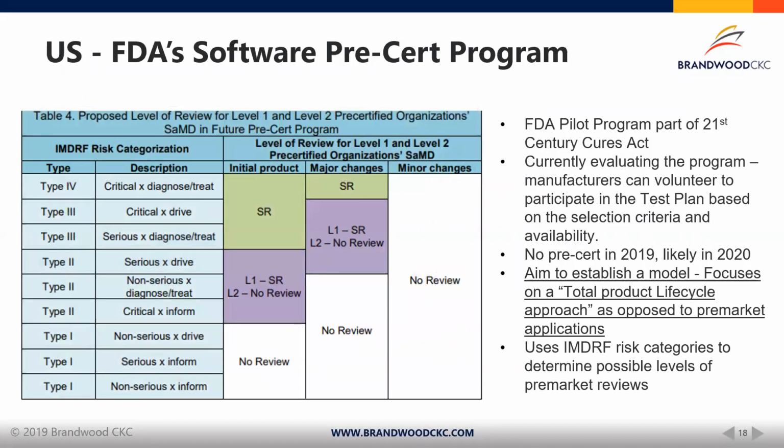In the USA, there also has been a lot of work done by the FDA on software or standalone software as medical devices. And the most relevant program which has been worked on is what's called the pre-certification program. So it's a program that's currently being evaluated by the FDA. Manufacturers can volunteer to participate in a phase that's a test plan for the implementation of this program. There are strict selection criteria and availability for manufacturers to participate. But nevertheless, participation of manufacturers will shape the future of the regulation. Therefore, if you are eligible, we highly encourage you to participate in this program. It's likely that the formal kickoff of this program will be towards the end of 2020. As I mentioned, this program is still under evaluation.